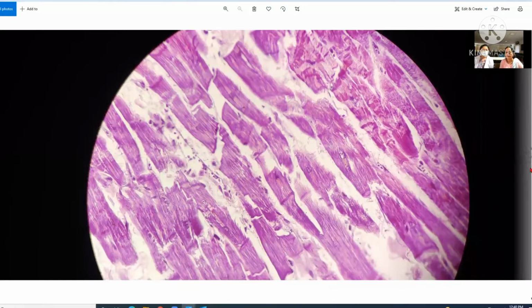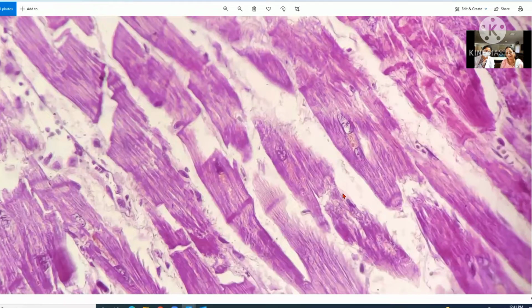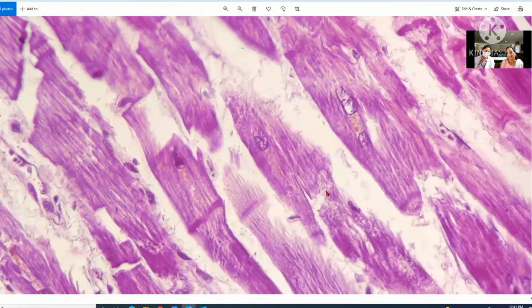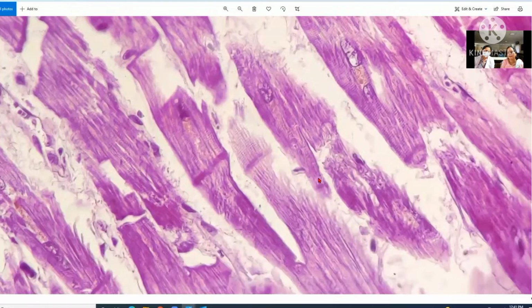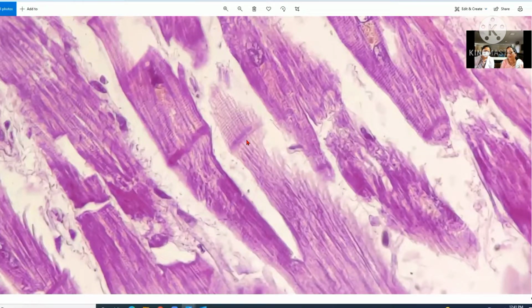So this is a similar picture. We were seeing the video, and then you can see beautiful myofibers. Very nice striations. You know, so this is what the technicians do. They know what stain to use and all that. You ask them anytime, they say PTAH.